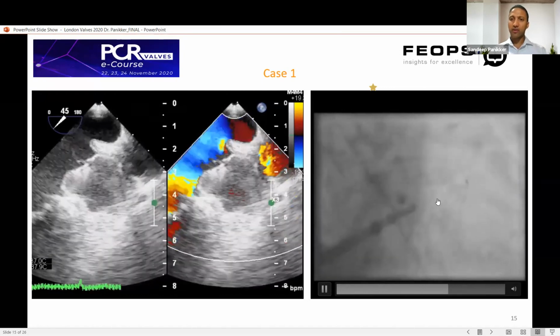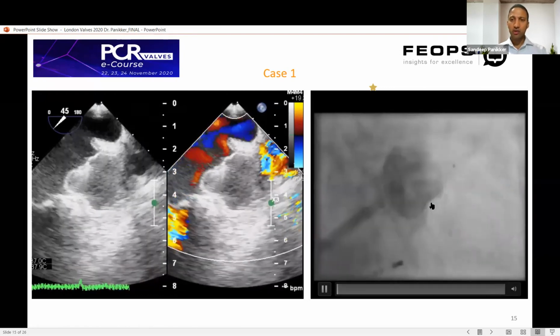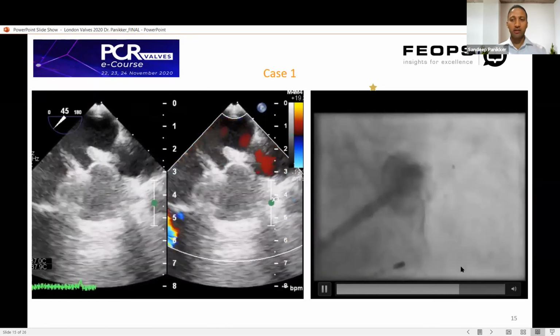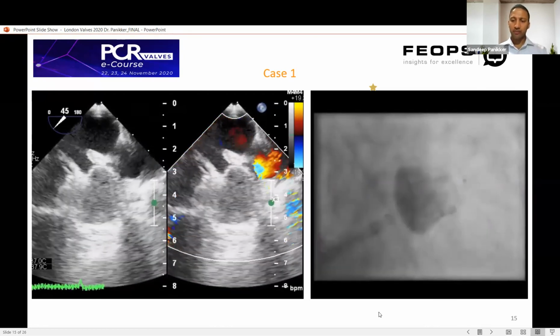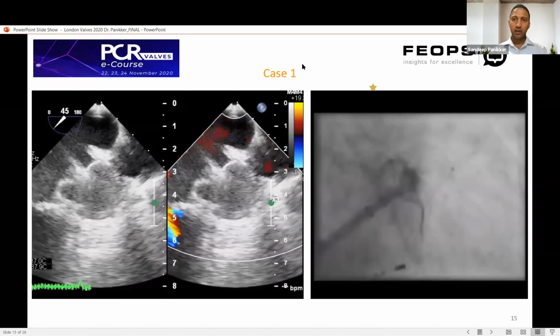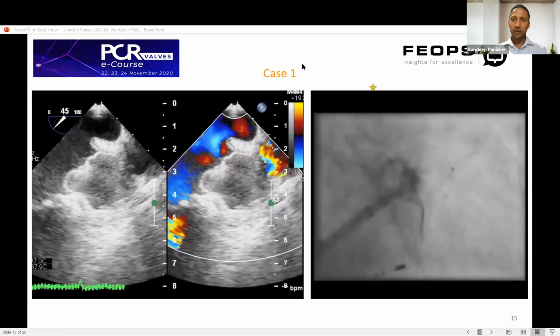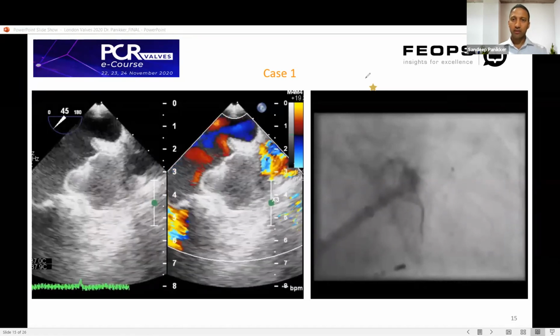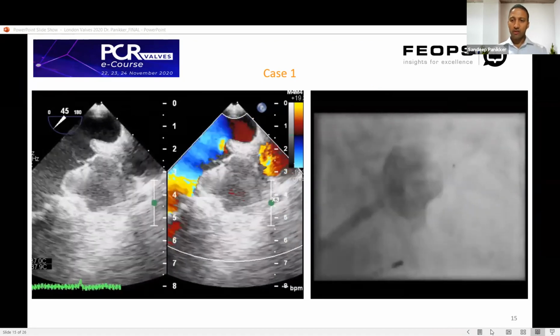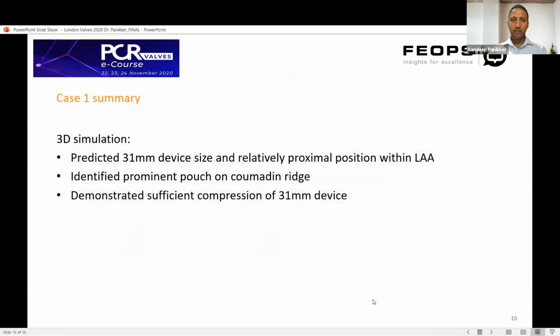And as those of you who implant these devices know, there are two rows of anchors which come below the 50% mark and then even below that too. So this is well positioned there. Let me just clear that off. Okay, so moving on to the next screen.